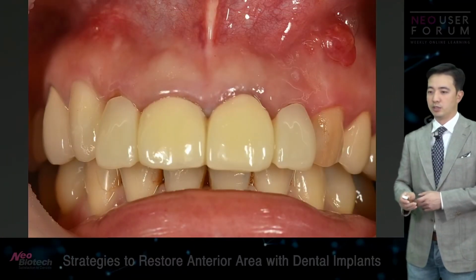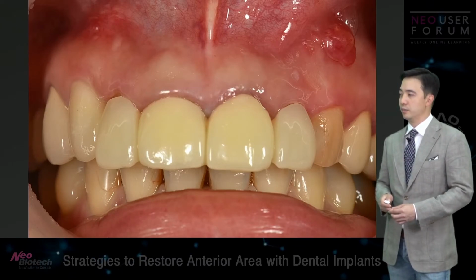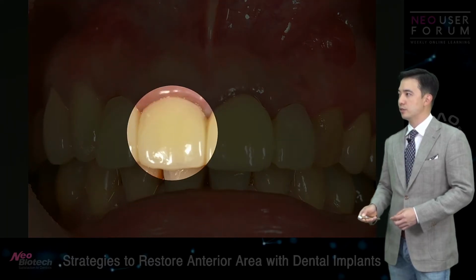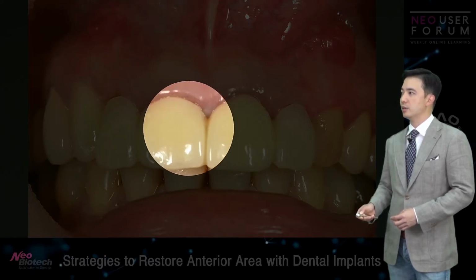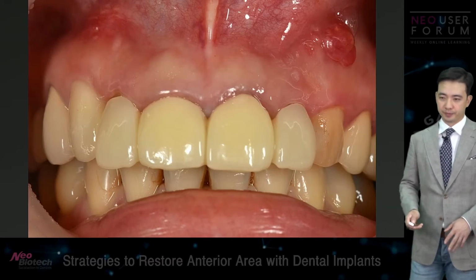The photo that I wanted to show you was post-op, but yeah, I just used the composite cap technique that I mentioned last time. This is post-op, I think 2 weeks or something. So the provisional restorations were supported by number 11 and 21, and 12 and 22 were just cantilevers.